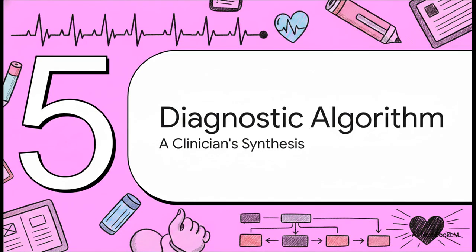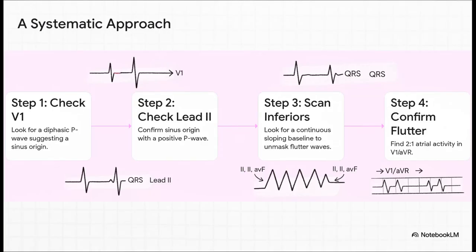Okay, so we've looked at the theory, we've gone through the cases. Now let's pull it all together into a practical step-by-step diagnostic algorithm that you can systematically apply to any regular narrow QRS tachycardia you encounter. So here it is, the final algorithm.